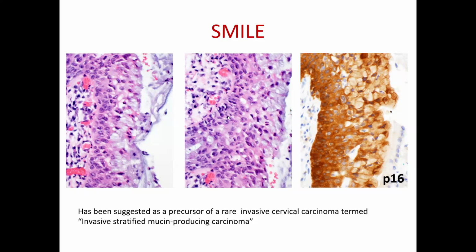So this would be high-grade. It would be CIN3. If you call it that, that's fine. But if you notice, you can't really call it CIN3 because what are you going to do with all of these mucin-producing cells? Here it is. Look on the left side in this field, you have those mucin-producing cells. But I don't think it is just metaplasia because we have mitosis here. I have to call it something. And if you do P16, it is positive, diffuse, and strong.